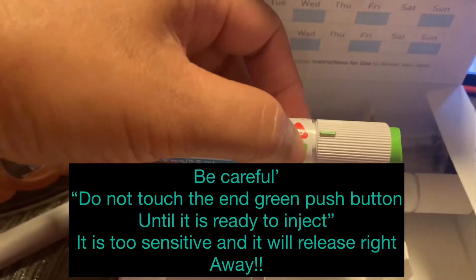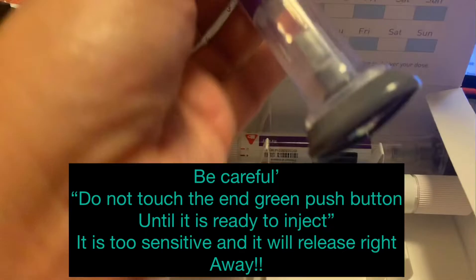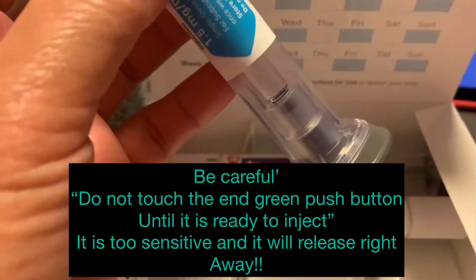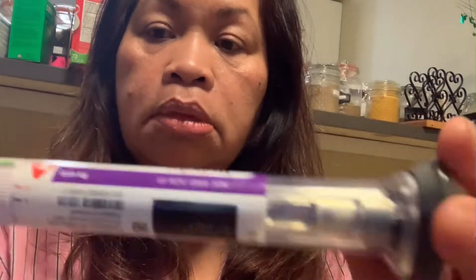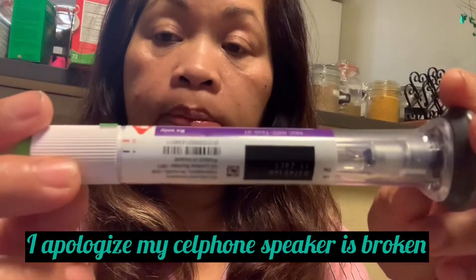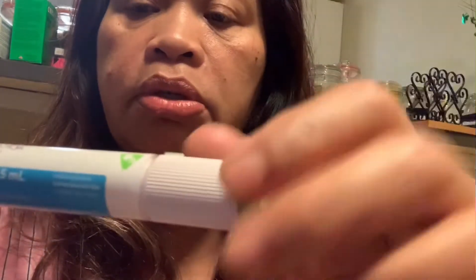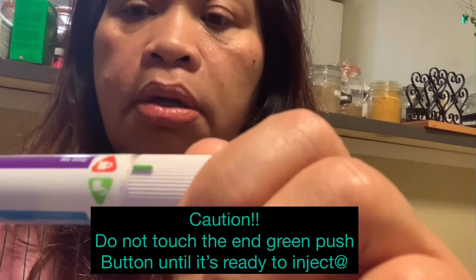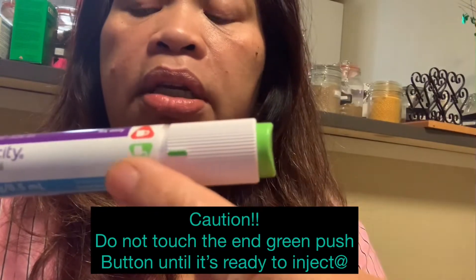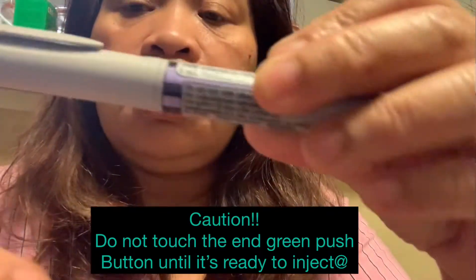You have to twist it to the green to turn the needle on, and then the end has a cap that you have to open before you inject it in your body. I'm going to twist this one to green because this is closed. When you're ready to use it, just turn it on and click — now the green is showing. It's easy, just like that.